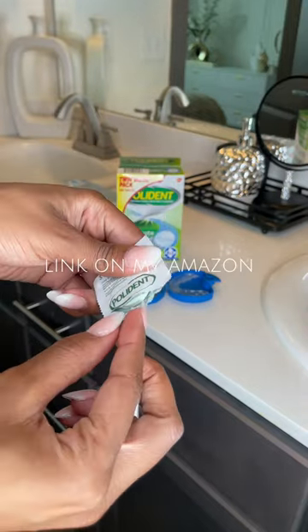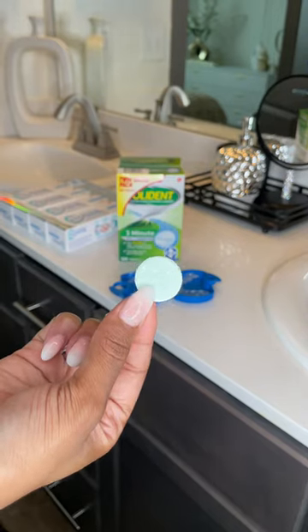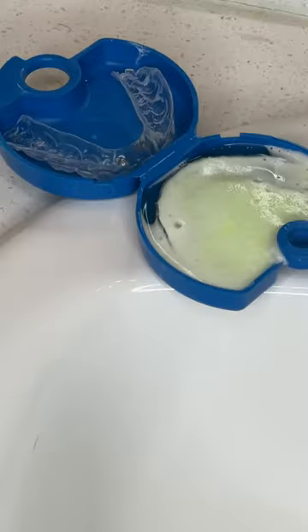Polident is a little tablet. It comes in this little white thing. I just take it out, put it in a retainer case on the side that doesn't have a hole. And I let that soak sometimes for three minutes, or I let it soak from the time I take it out in the morning, just so it can be extra clean.